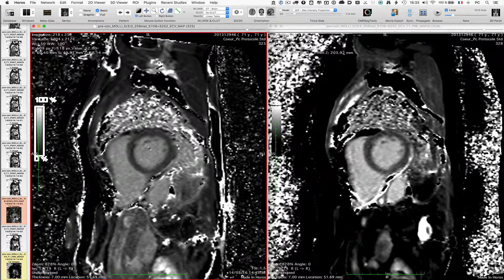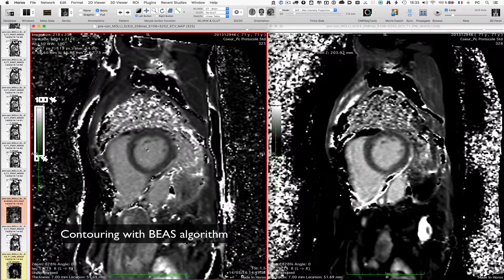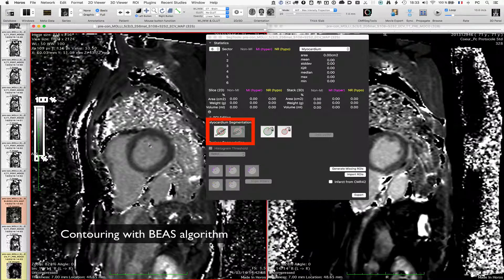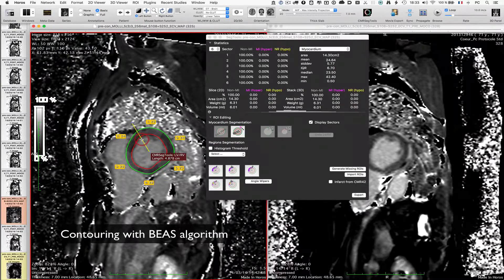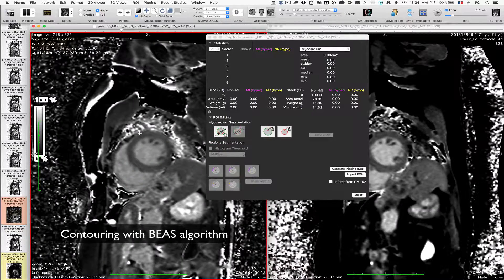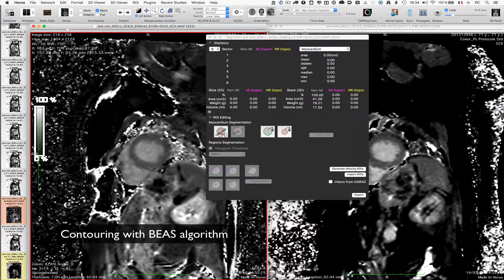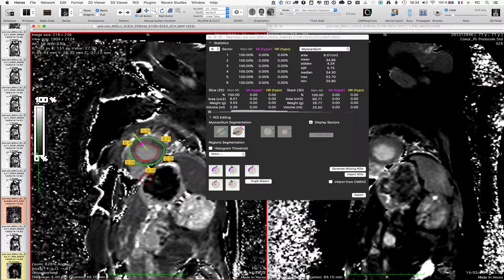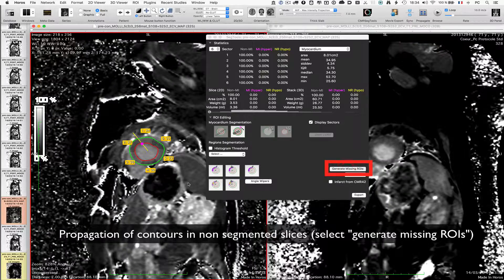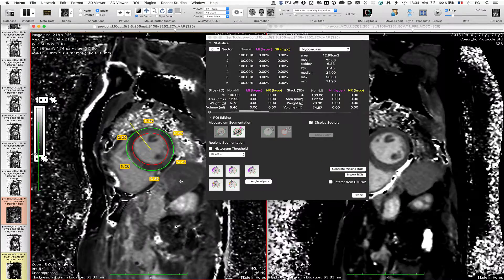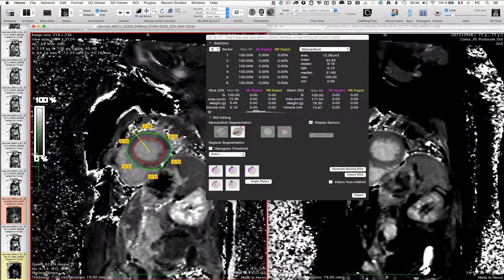I'm going to start with the contouring of the first stack, which is the ECV map. I will perform some contours, maybe every two or every three levels. Then I generate the missing ROIs, so I have all my contours copied and interpolated.